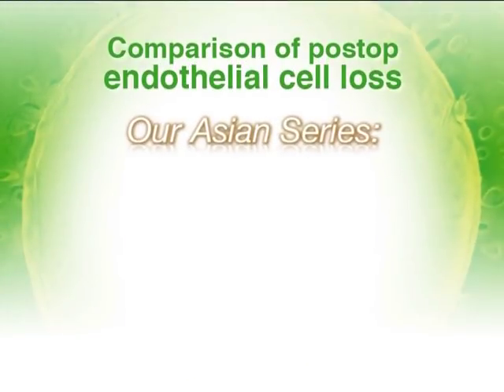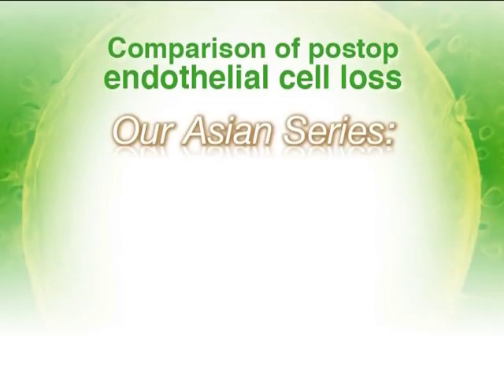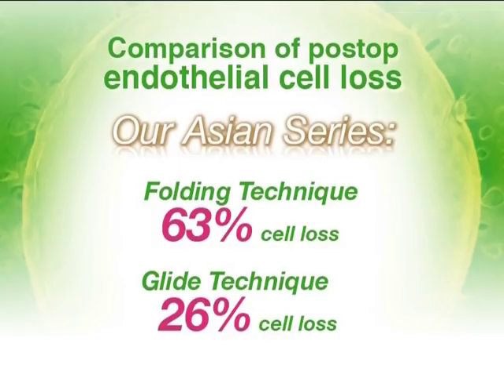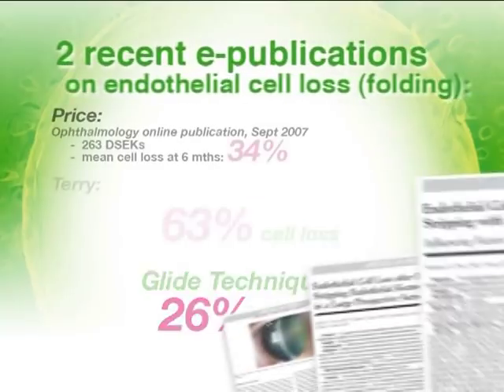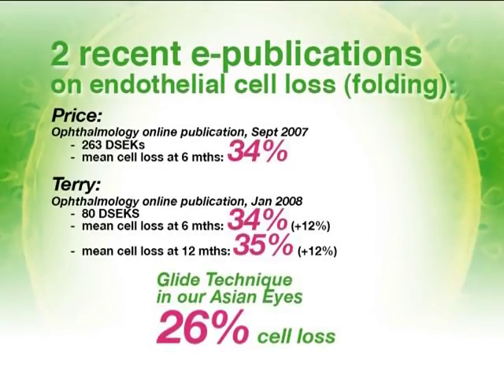Finally, our preliminary postoperative endothelial cell count data suggests a high 63% cell loss in the folding cases as compared to a 26% cell loss in our glide cases, a reduction by almost 60%, suggesting that the glide technique in our smaller Asian eyes is able to certainly match the reported 34% cell loss rates in larger Caucasian eyes.